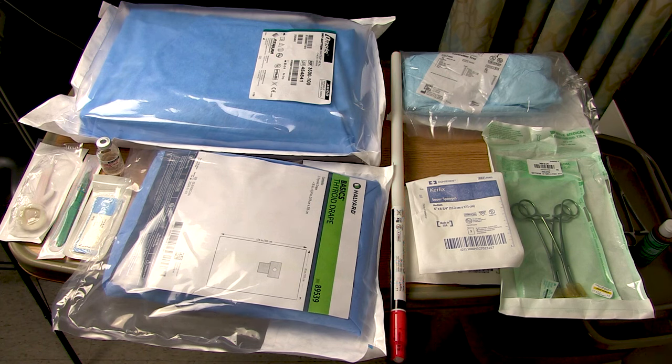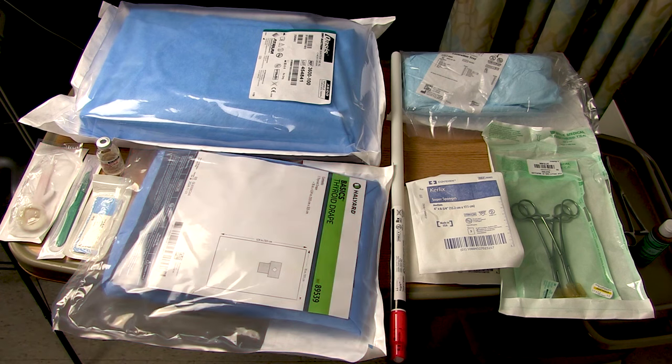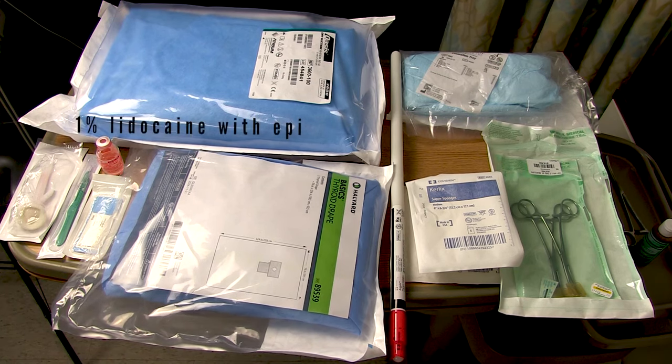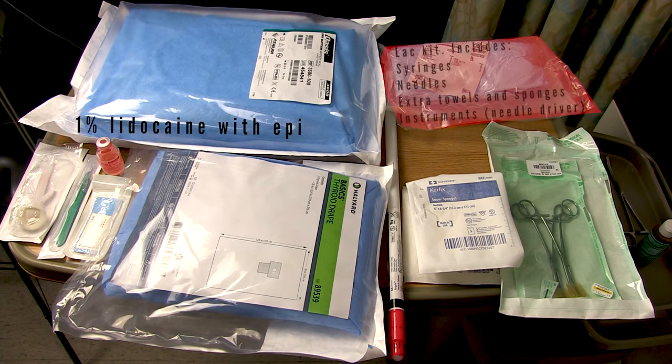Unless you're in a trauma or crash situation, you should have something to prep and drape with — here I've got a stick of chlorhexidine and a thyroid drape. Unless the patient's already anesthetized, bring some local with you as well as a syringe and needles to draw it up and inject it. I like bringing the emergency room laceration tray from my hospital's ED because it includes the syringe and needles I need, and it also has some extra towels and sponges.